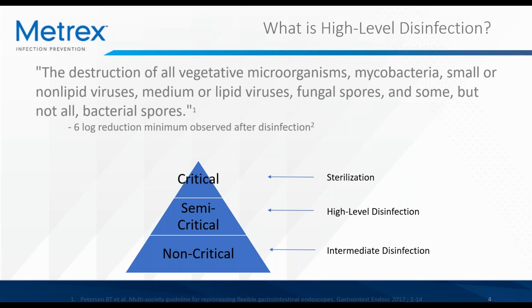Above intermediate level disinfection, we have high-level disinfection. High-level disinfection is defined as the destruction of all vegetative microorganisms, mycobacteria, small or non-lipid viruses, medium or lipid viruses, fungal spores, and some, but not all, bacterial spores. High-level disinfection is performed on semi-critical items.